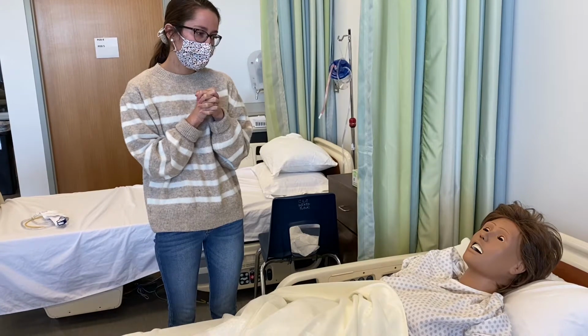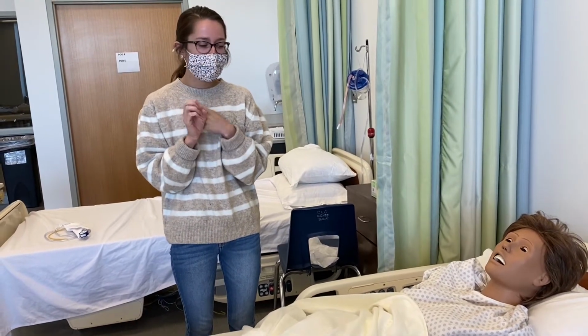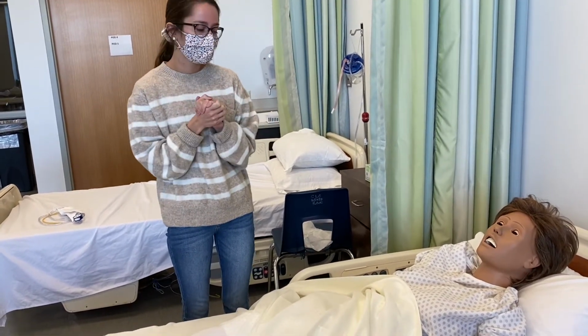I'm going to assess and ask when they last voided, assess the bladder for any distension, and I would also bladder scan them for any fullness within their bladder.